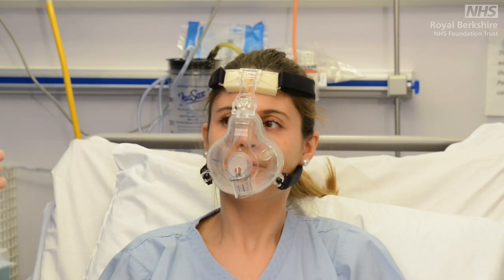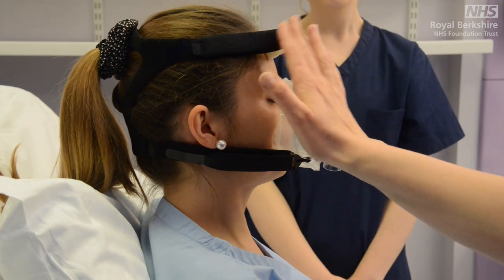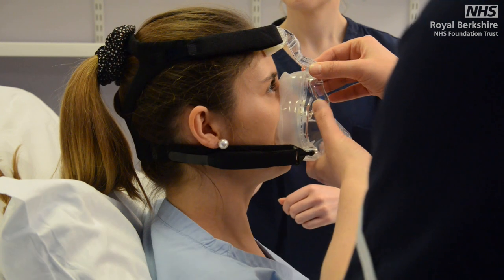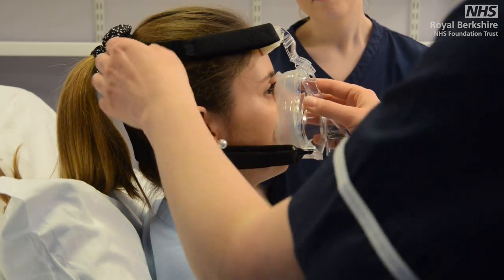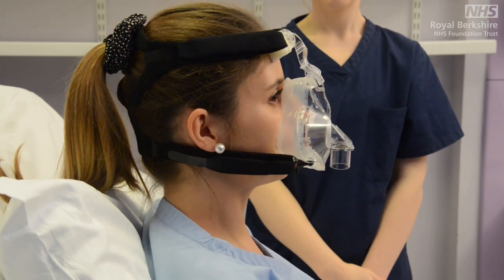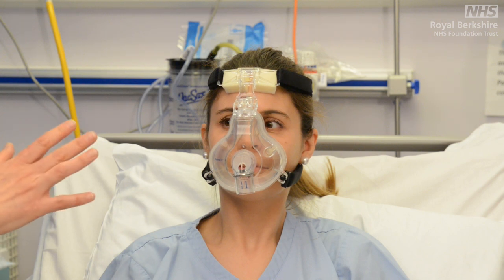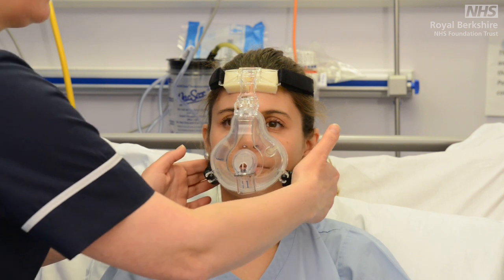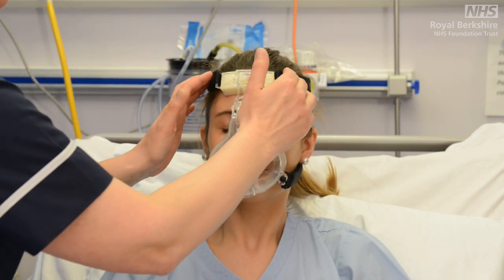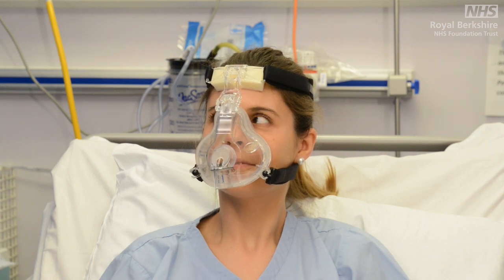The next check is whether we're happy with the fitting. There's a slight need for adjustment of the top straps — the top part needs to come in slightly tighter. After a small adjustment and gently tightening those straps, it's now looking much more in a vertical position. Then just double-check — what I call the hairdresser's check — running your fingers along to check that the straps are in the same sort of place on both sides. Both the bottom and top straps are level. Looking from the back of the bed makes it a lot easier to see that. We're now ready to attach our patient to the non-invasive ventilator.